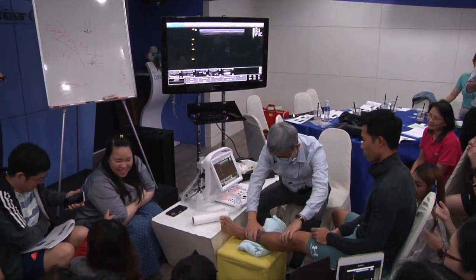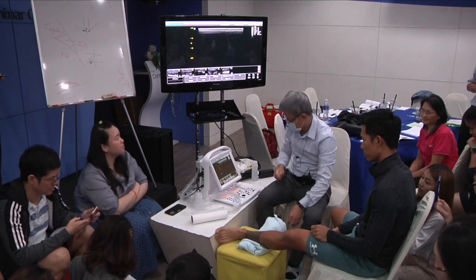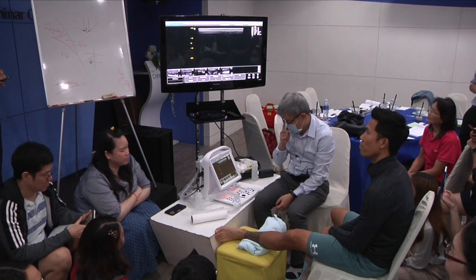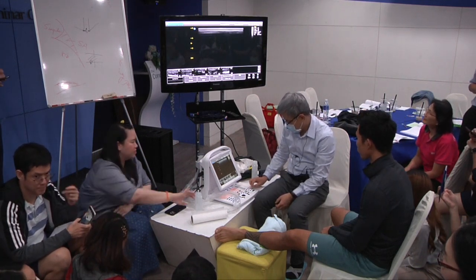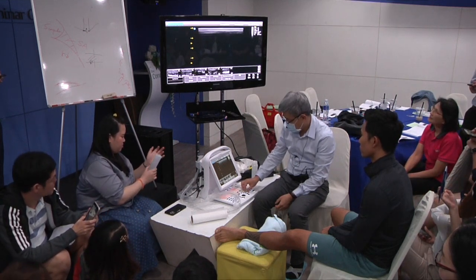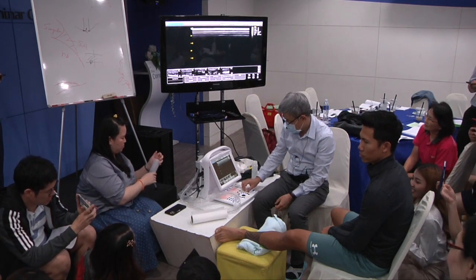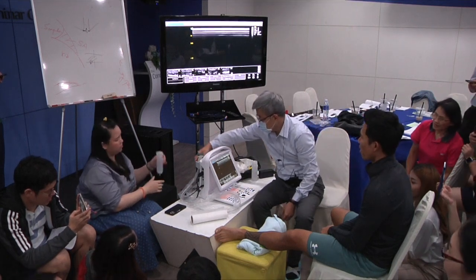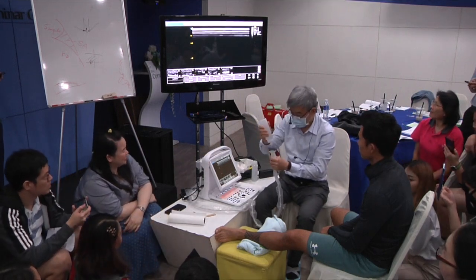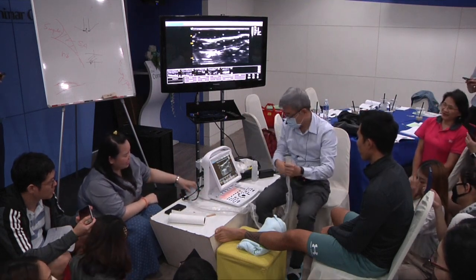And external rotation. Yes. Okay. And slight eversion. Slightly there. Okay. So we need to change to... okay, cool. Good. Oh, it's almost empty. Good. Very easy.